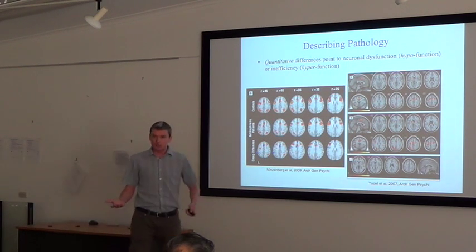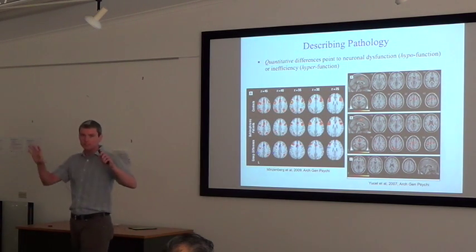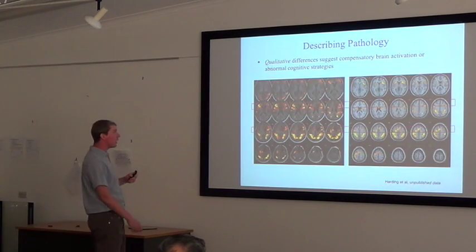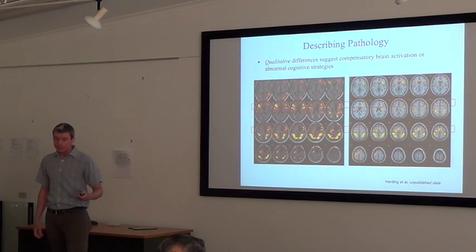But in psychiatry, generally, this is what we see. We see a similar pattern of activation, but we see a quantitative difference between the two. But we can also have a look at qualitative differences.